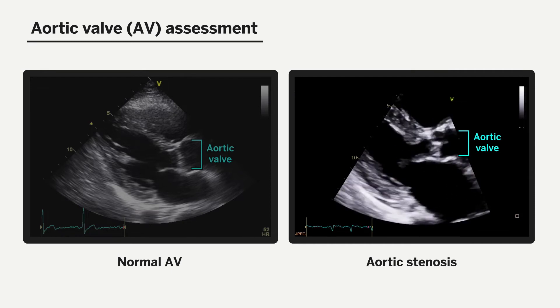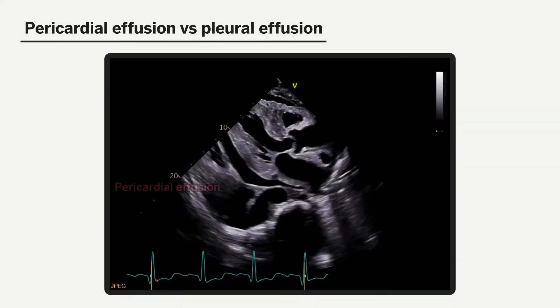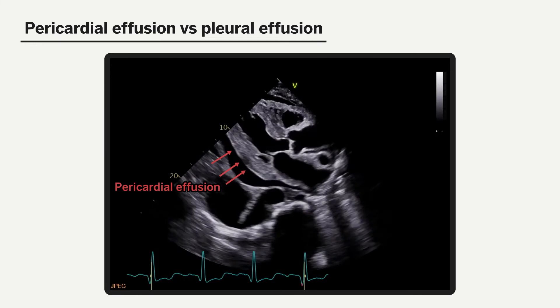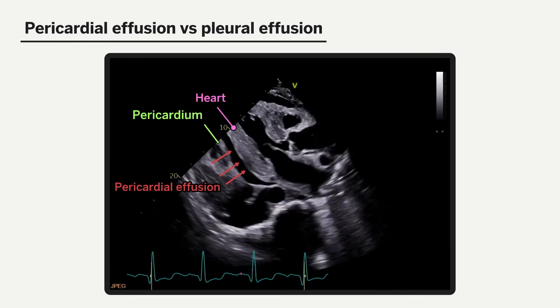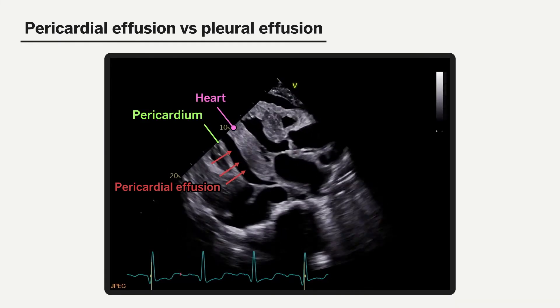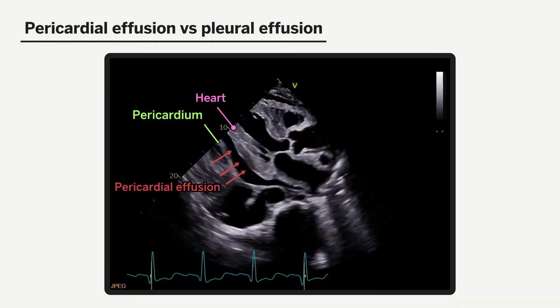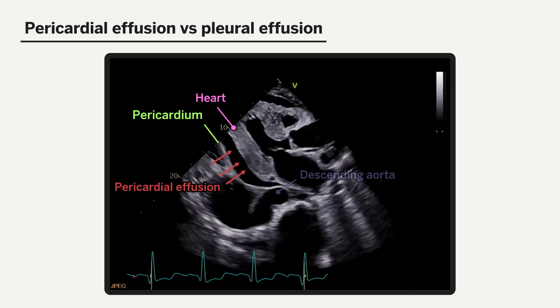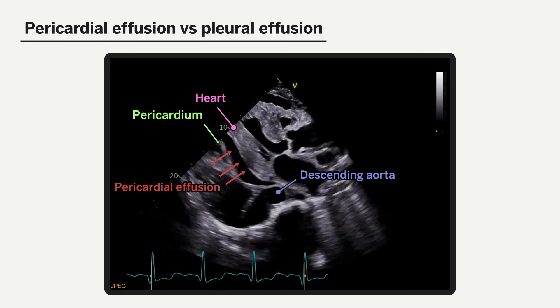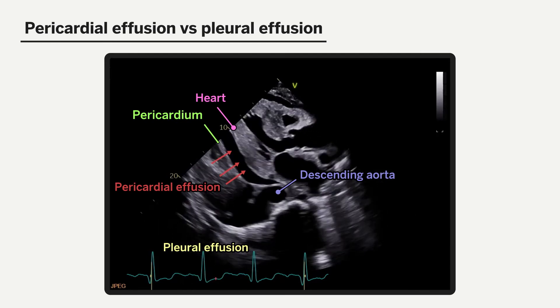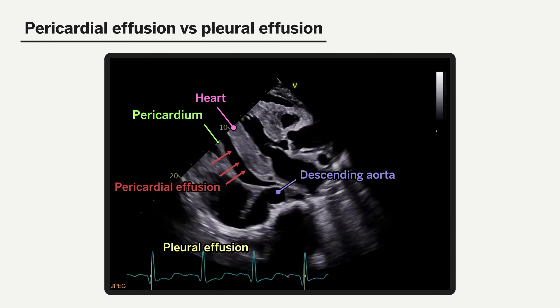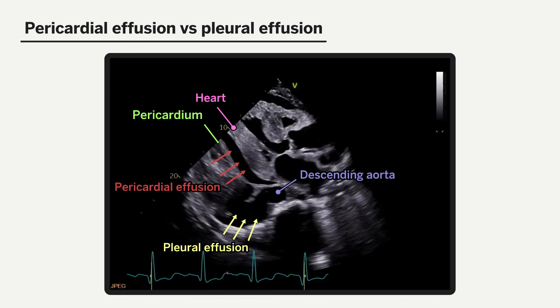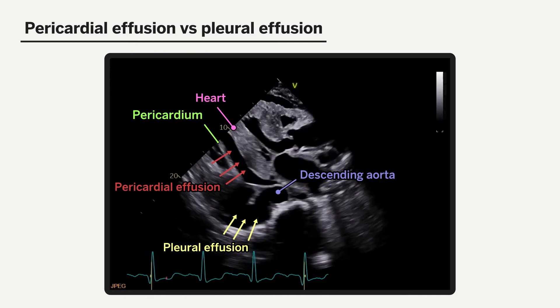The parasternal long axis view can also be useful for the assessment of pericardial effusions. A pericardial effusion appears as free fluid between the heart and pericardium, as depicted by the red arrows in this video loop, and can be distinguished from a pleural effusion by its position above the descending aorta. A pleural effusion, also seen in this video loop as demonstrated by the yellow arrows, will be located below the descending aorta.